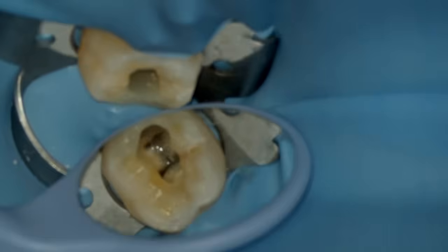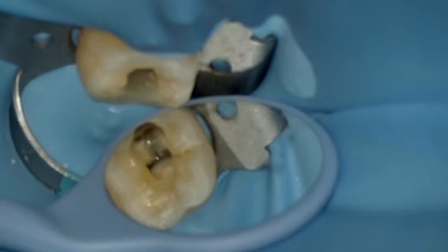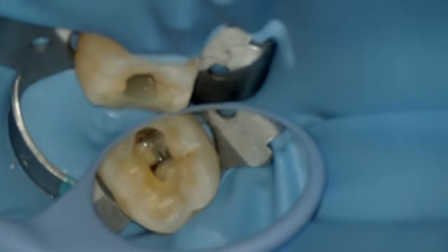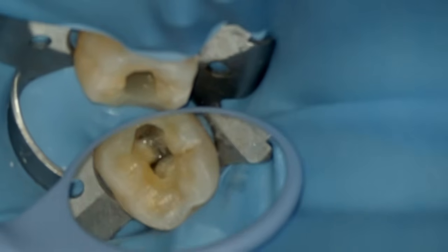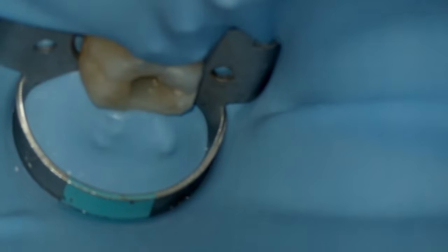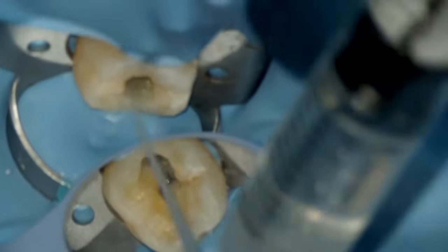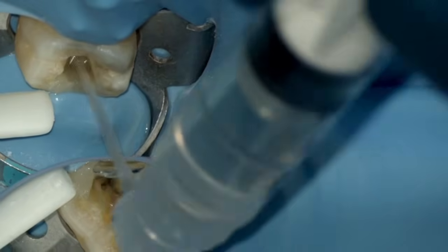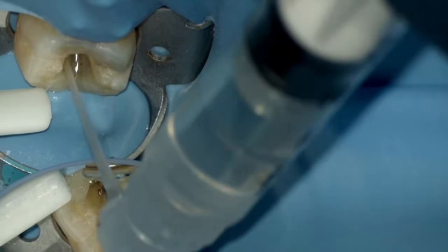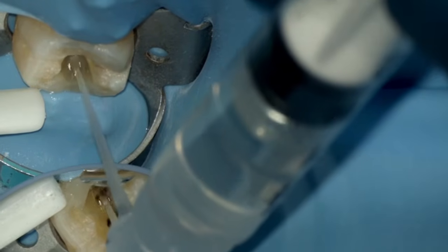Once we've done the coronal flare, actually in a few of the canals, with the use of a glide path file just short of what we believed the estimated working lengths to be, we were able to get patency in all of the canals. The distolingual took a little bit of time, and actually the MB was challenging right from the outset. We were struggling to get a size 8 down, but eventually we managed to reach there.